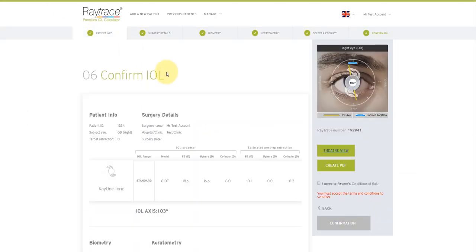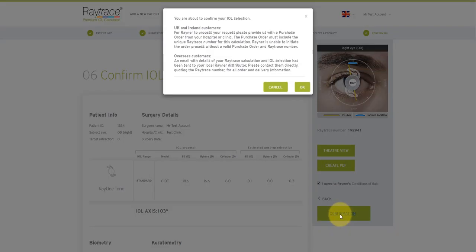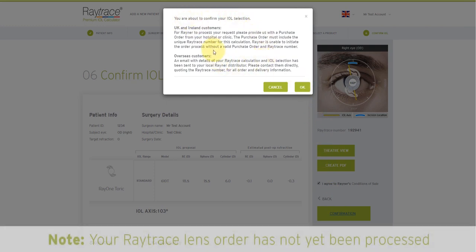Going back to the calculation. If you'd like to go ahead with your order for the chosen lens, please agree to the conditions of sale. Little tick box here. And then click confirmation. As a note here about ordering: please note that at this stage, your order has not been processed. Please contact the Rayner customer service team or your Rayner distributor to progress and finalize your order. You're going to be asked for your Raytrace order number, so please have it at hand or include it in your email.